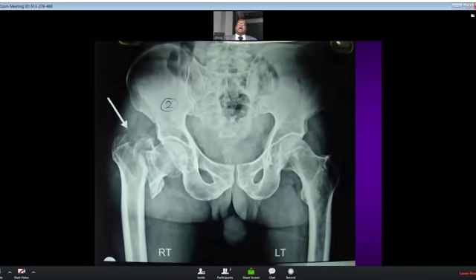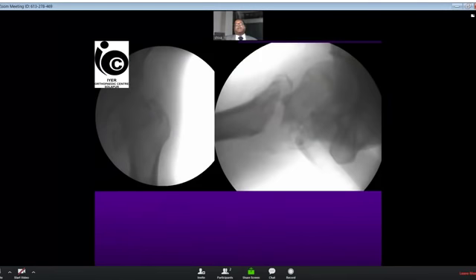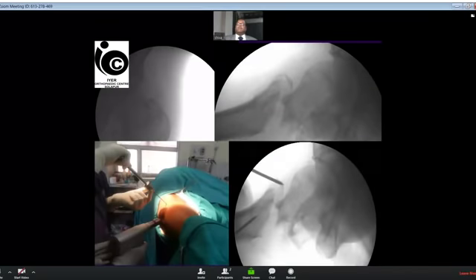How do I do this anteromedial reduction? Because many people ask me every time how we do these cases. Friends, this is an example. Both in AP and lateral pictures, the neck is widely separated. This is on the traction table, under traction, abduction, and external rotation. You can see a fairly good reduction. But if you see the lateral view, the neck is not 100% reduced.